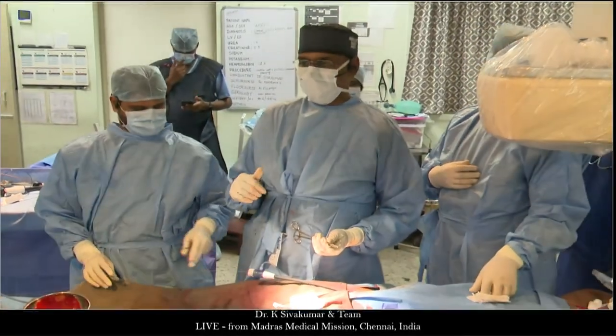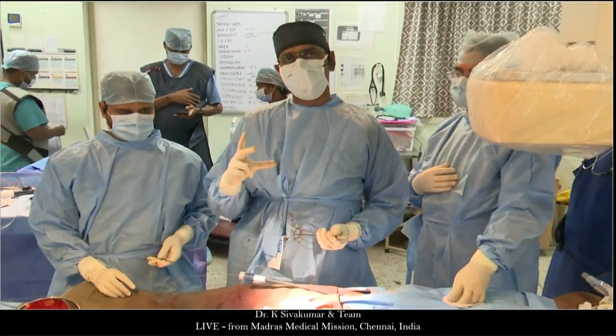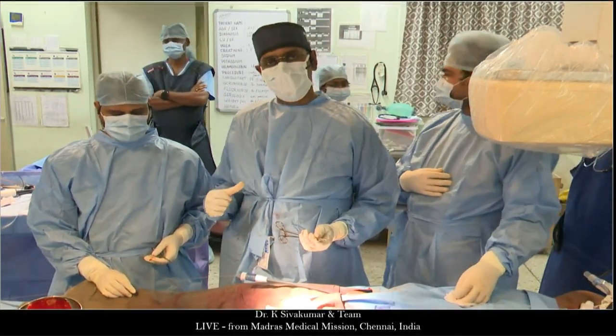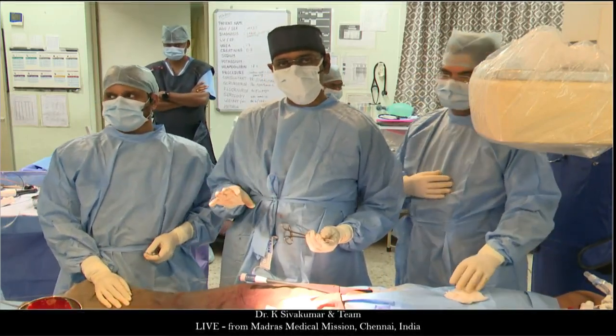We overlap the two. Recently we started getting this hybrid stent where the upper part is open and the lower part is covered, and we have started using this for these additional pulmonary veins. We never go and redilate any of the struts.